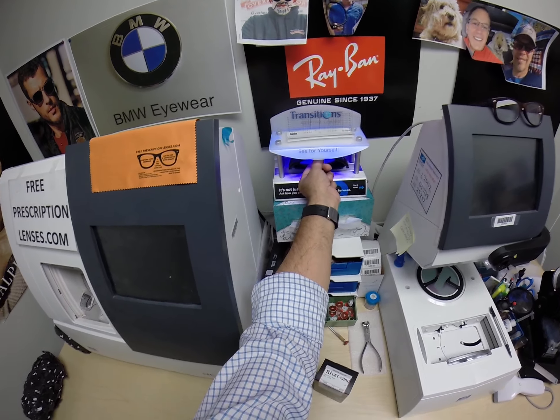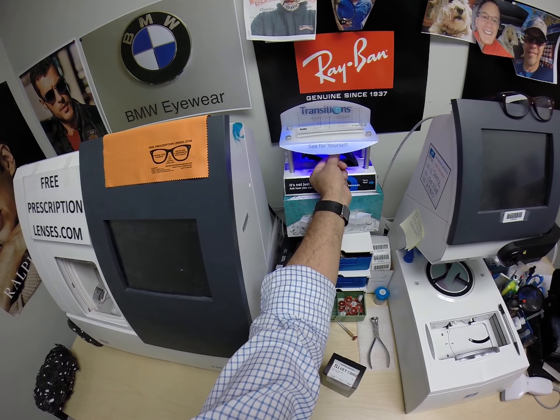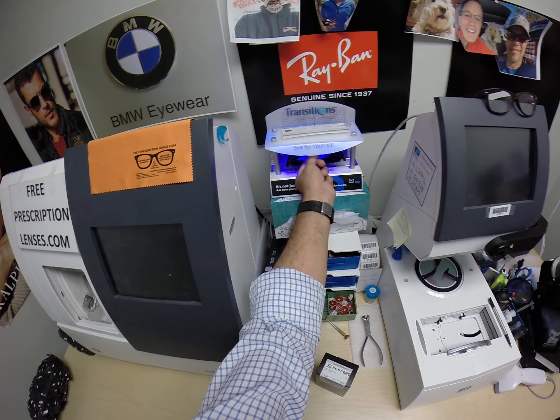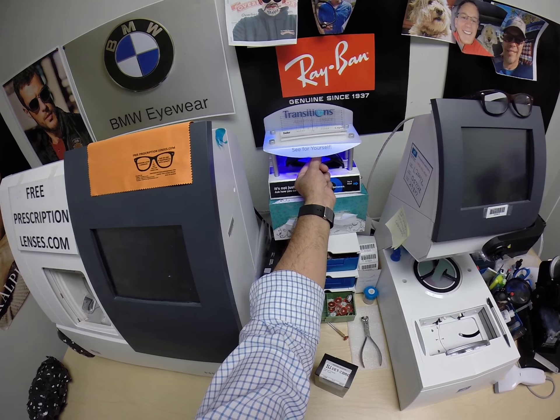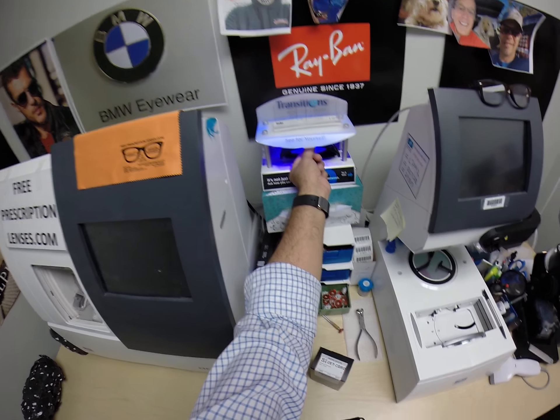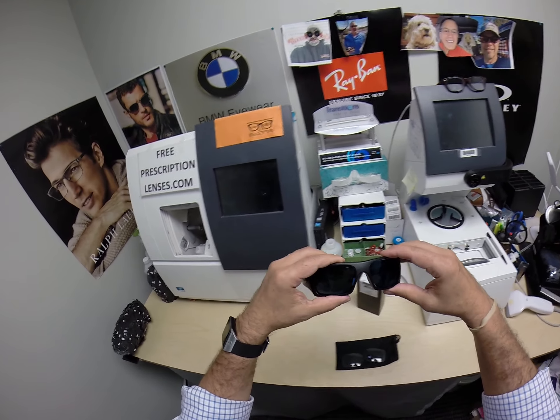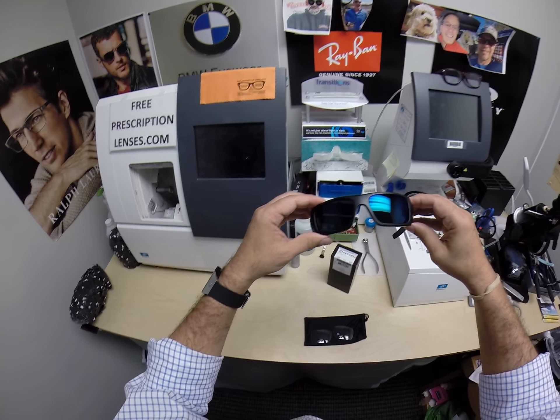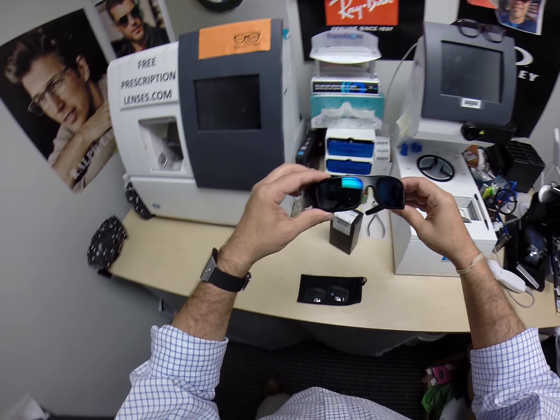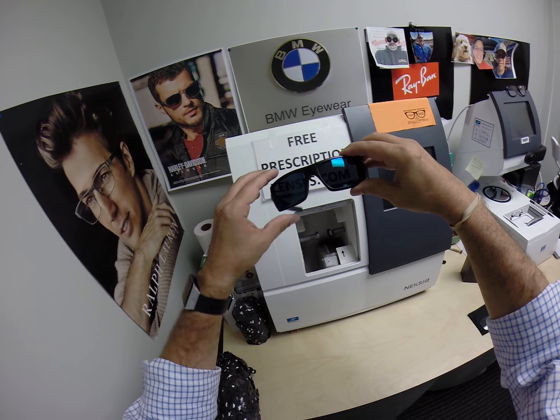The only time Transitions 7 and 8 won't work is if you're behind the windshield of a car. Your windshield absorbs the sun's harmful ultraviolet rays — that's why they don't get dark in a car. However, these Transitions XTRAactive will get 30 to 50 percent dark behind a windshield. And if you have a convertible or a motorcycle, all transition lenses will get dark. The XTRAactive with the green flash mirror is pretty cool.